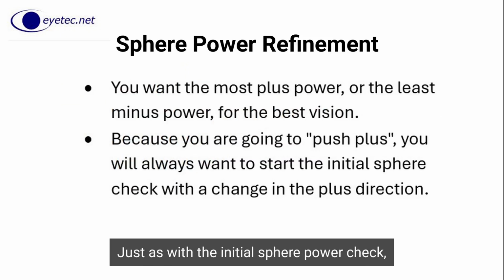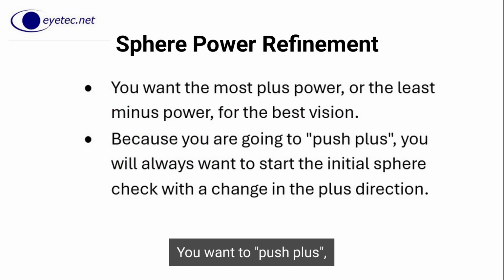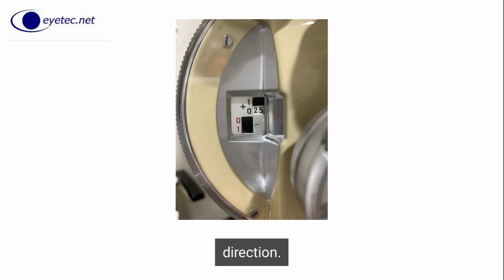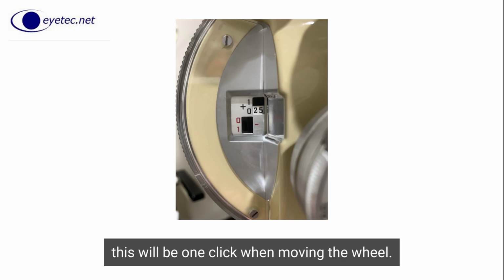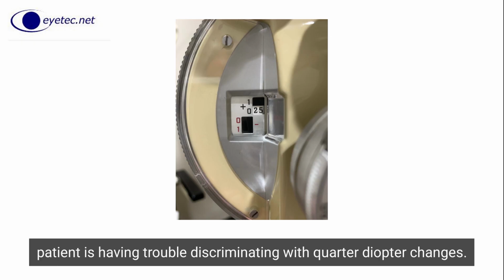Just as with the initial sphere power check, we want the most plus power, or the least minus power, for the best vision. You want to push plus, so you will always start the initial sphere power testing with a change in the plus direction. You will again be using the sphere power wheel. If the patient is seeing well, you can use quarter diopter changes to test. This will be one click when moving the wheel. You can again use half diopter or larger changes if the patient is having trouble discriminating with quarter diopter changes.